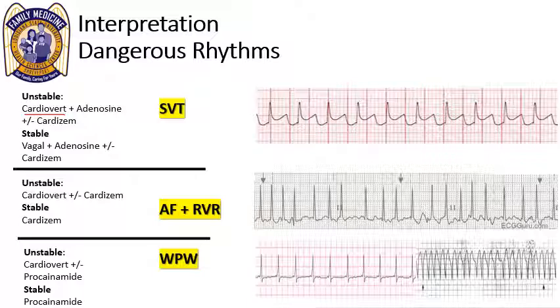So what do you do with that? Well, you're going to recognize the rhythm. This is an obviously irregular rhythm. You cannot appreciate P waves, and even if you do, they look somewhat fibrillatory. This patient's obviously in extremis. They're not doing very well. You start with cardizem first, unless they're unstable. Unstable means hypotensive, they're unconscious, things like that. And you're going to give them the cardizem dose.